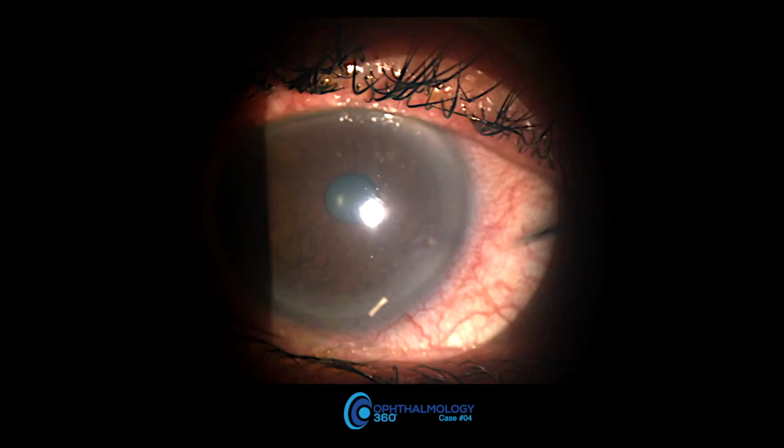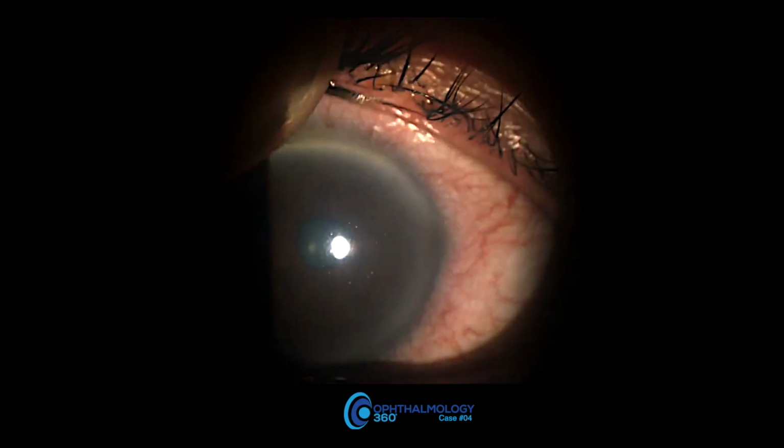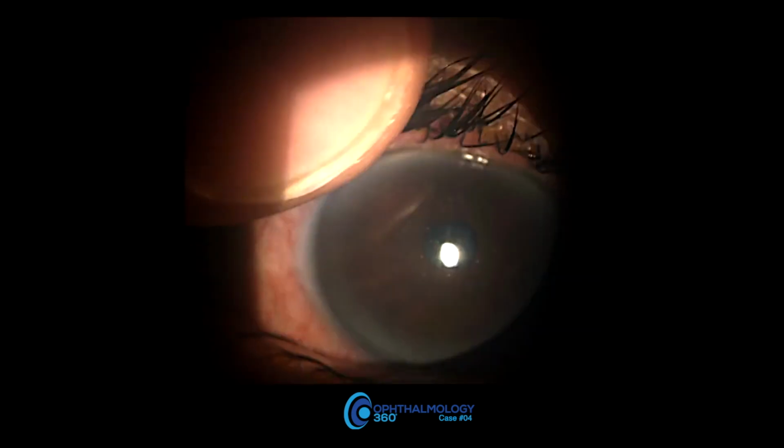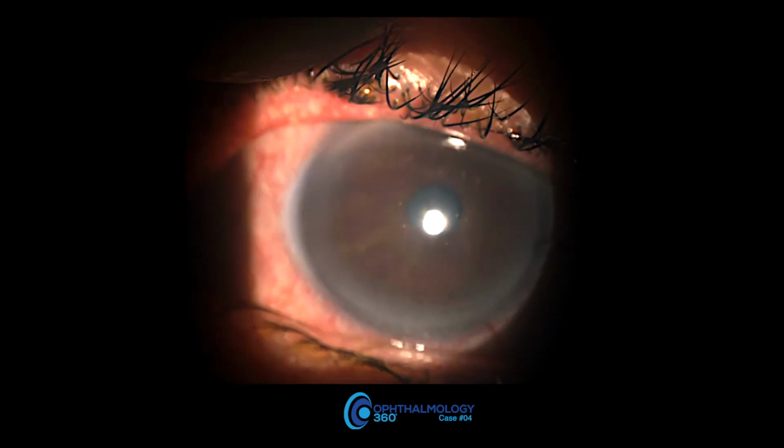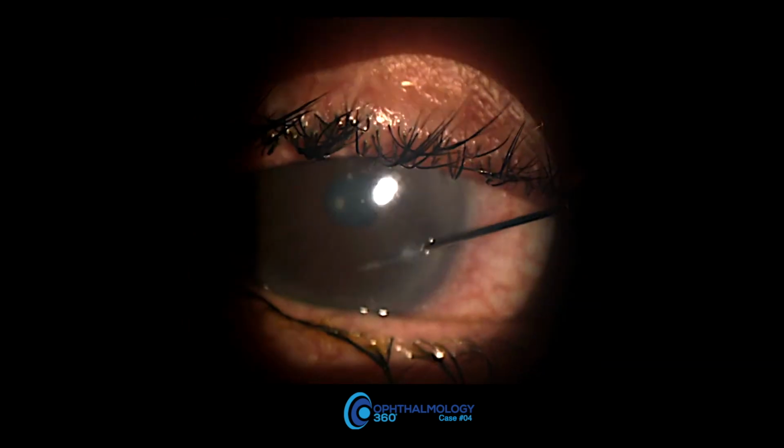And I just go back and forth a little bit, and it comes down like a little bit of a log tumbling down, and it finds its home somewhere between 5:30 and 6:30 almost always.